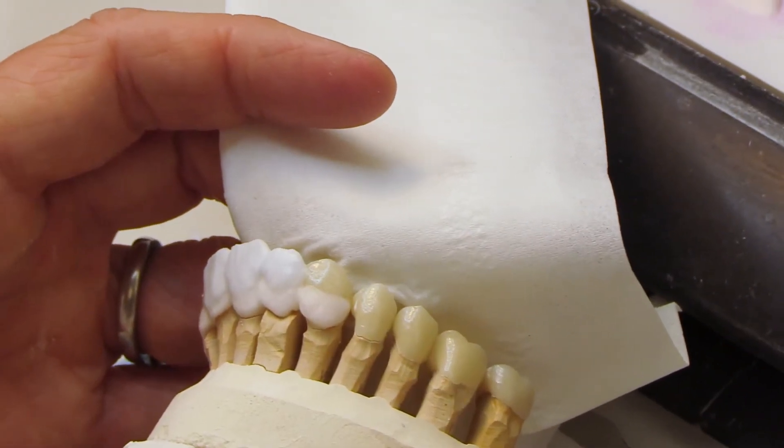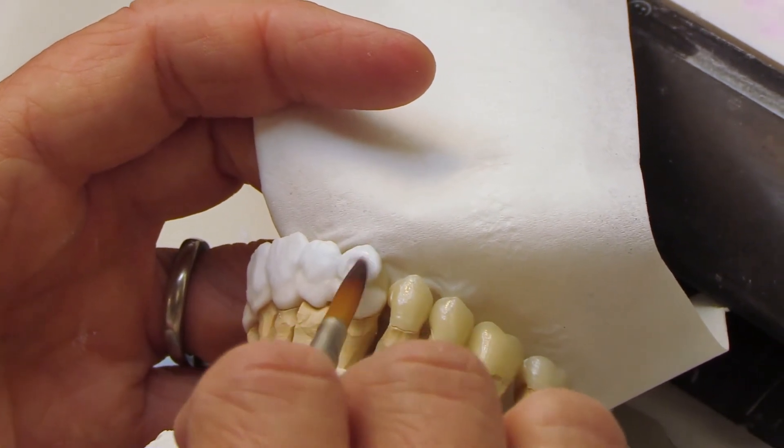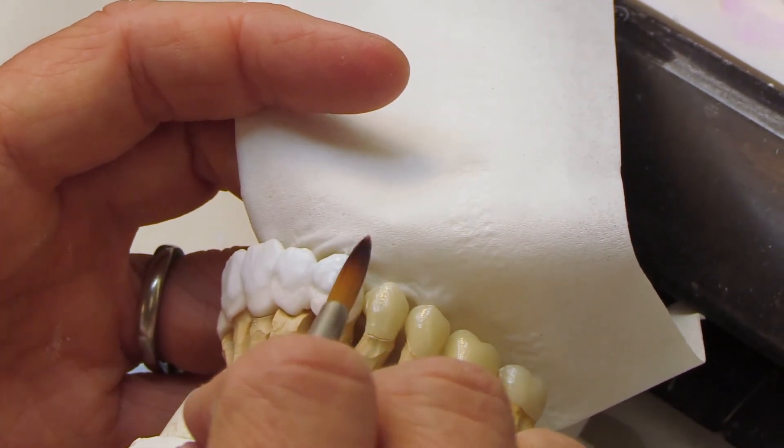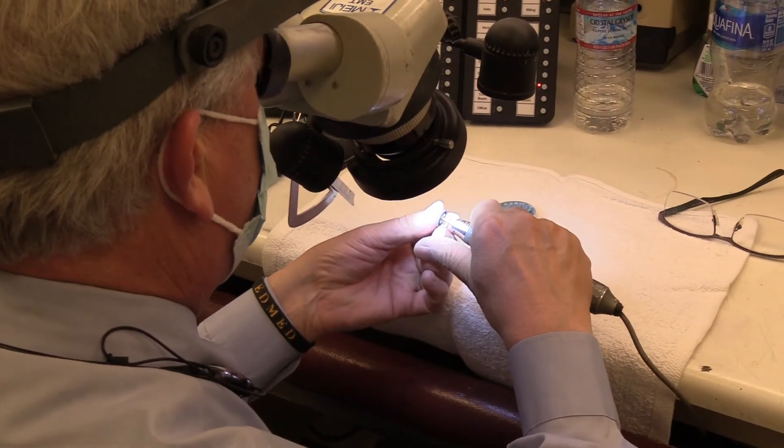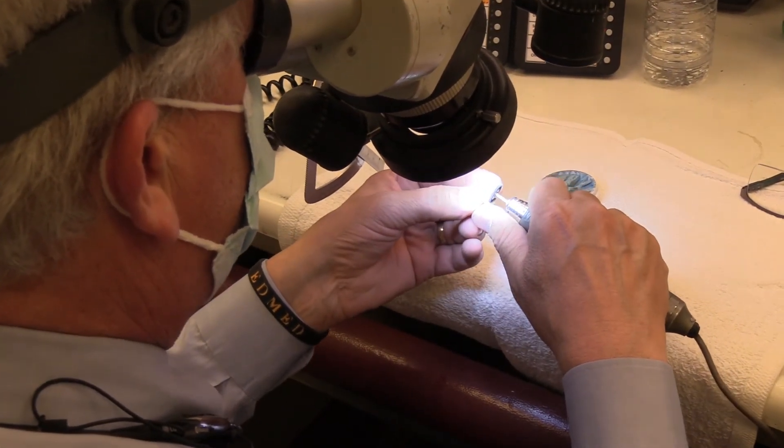We begin with a full contour design, followed by a minimal cutback of the facial surface. After the zirconia is milled and sintered, ceramic is custom-layered to the facial surface by one of our ceramists. The exposed zirconia is then hand-polished for a smooth and strong surface, which is very important to prevent wear to the opposing dentition.